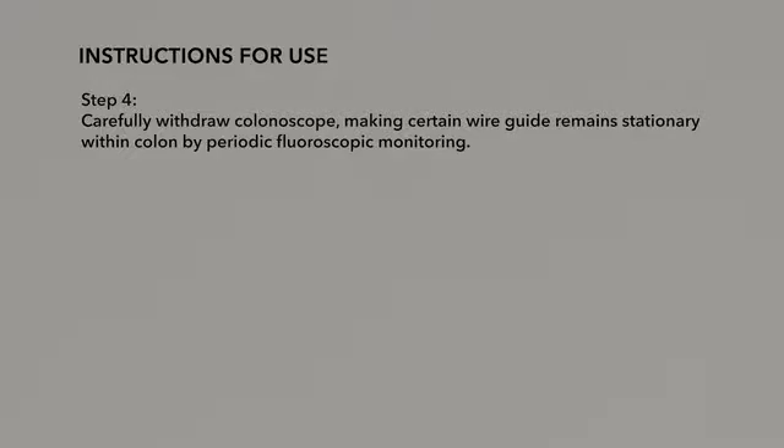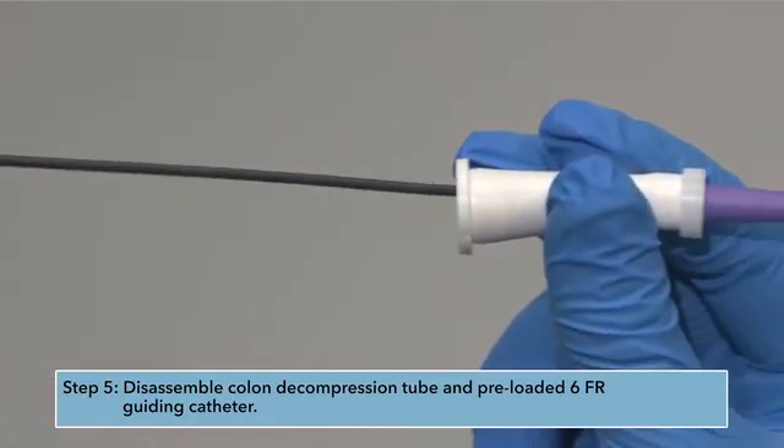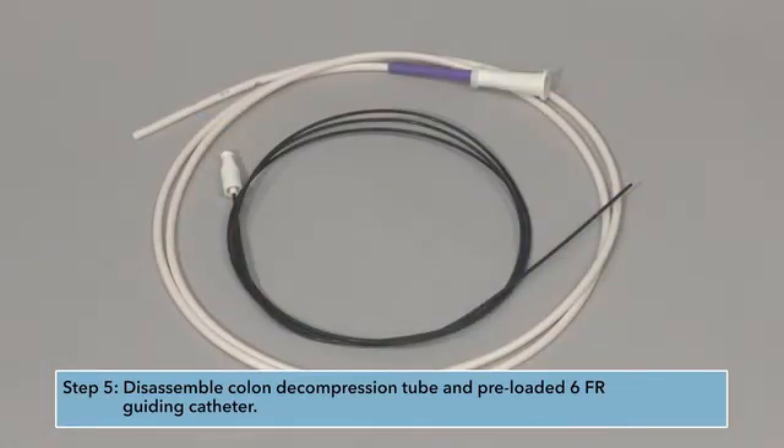Step 4: Carefully withdraw the colonoscope, making certain the wire guide remains stationary within the colon by periodic fluoroscopic monitoring. Step 5: Disassemble the colon decompression tube and preloaded 6-French guiding catheter.